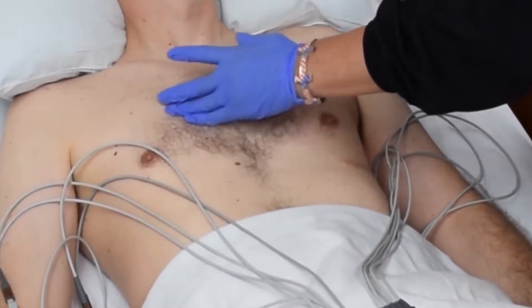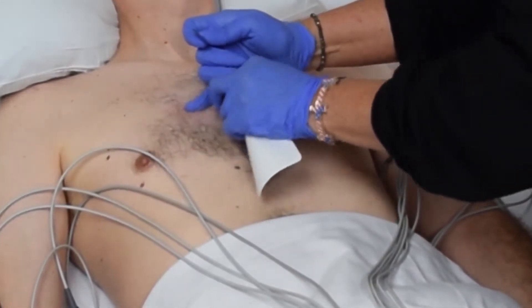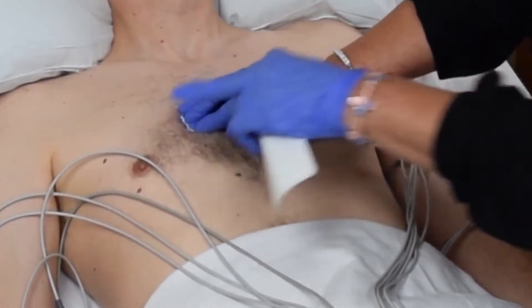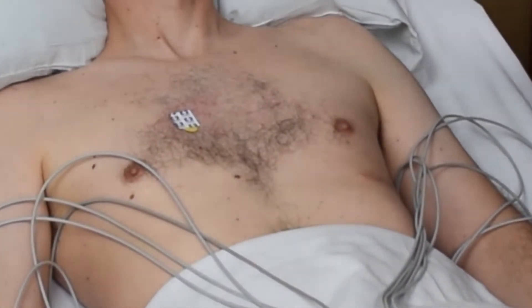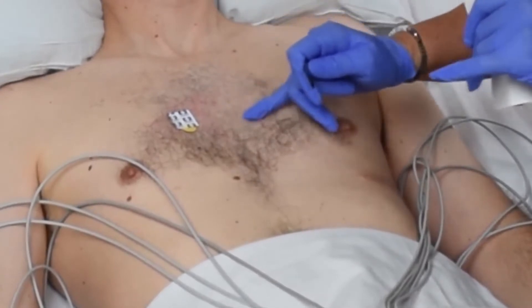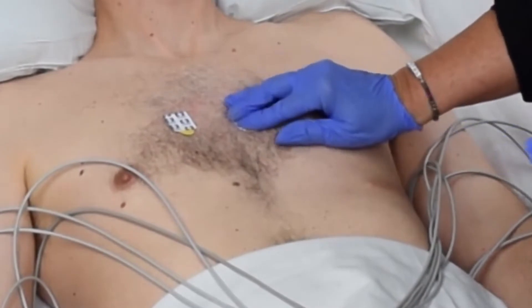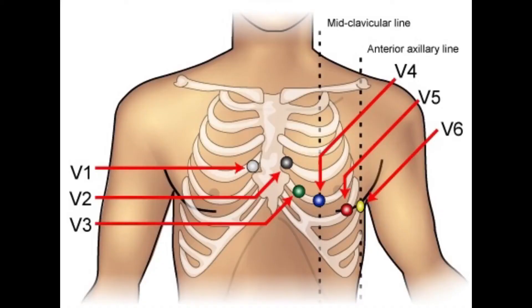Place the V1 electrode in the fourth intercostal space, just to the right of the sternum. Place the V2 electrode in the fourth intercostal space, just left of the sternum. Note that the electrodes should not be greater than two centimeters apart.